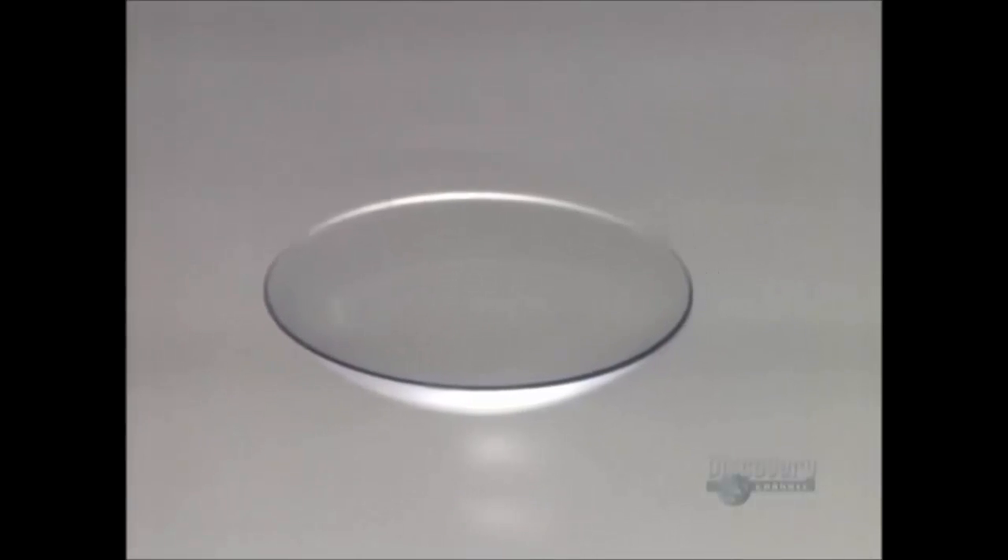The polymer is then hydrated to make it flexible. Lenses remain immersed in a balanced pH saline solution for 24 hours. The lens becomes engorged with liquid and expands, reaching the desired proportions.